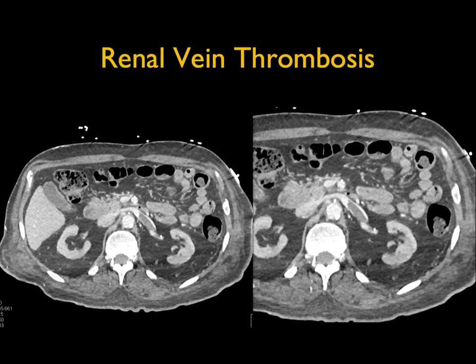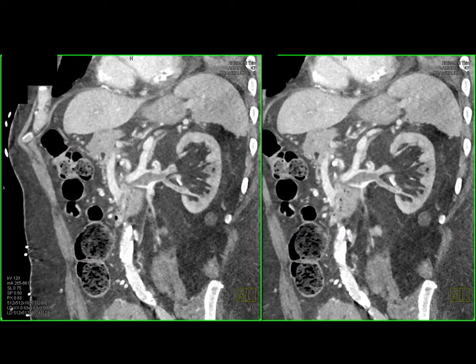What are we looking for? You're looking for the renal vein. Sometimes you pick it up incidentally. This patient had abdominal pain, and this was probably the reason. Look at the renal vein — the left renal vein is dilated, there's some rim enhancement, but it's totally thrombosed. Despite the extensive thrombosis, the perfusion changes in the kidney are very minimal. Another example: look at the thrombus in the patient's left renal vein, very nicely shown.